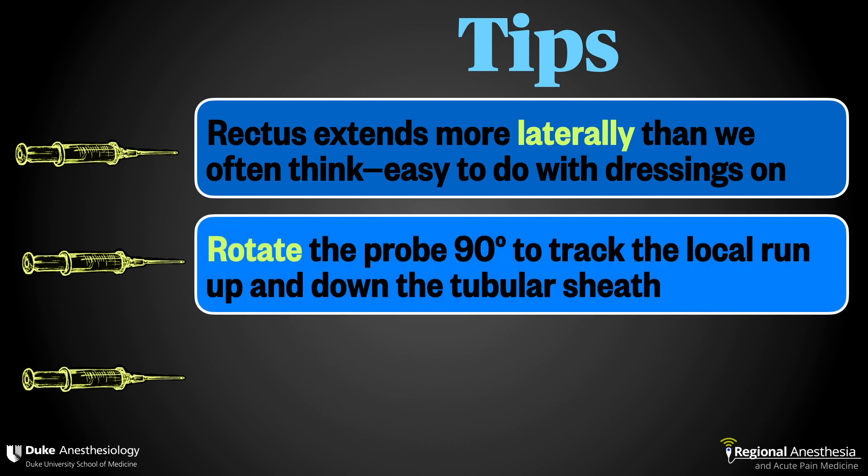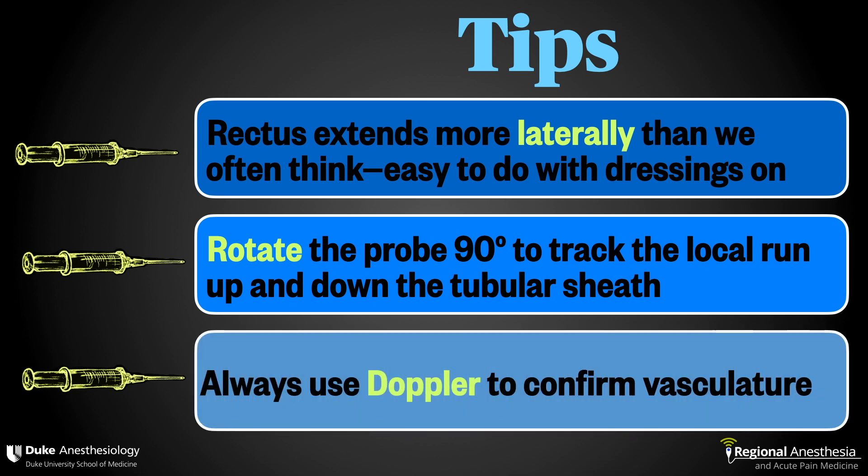Number two: I like to rotate the probe 90 degrees after my injection so it's in the parasagittal orientation. You'll still see the muscle and the rectus sheath, and with this view you'll be able to track the local anesthetic bolus up and down the sheath to confirm that you're getting the appropriate spread.